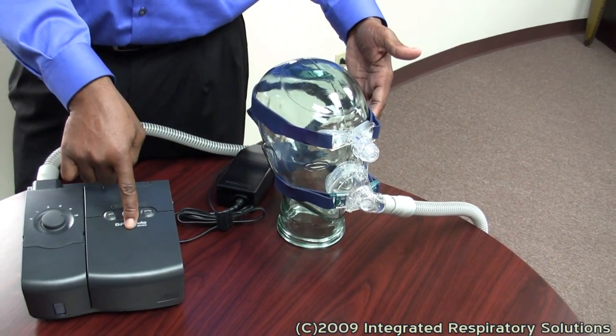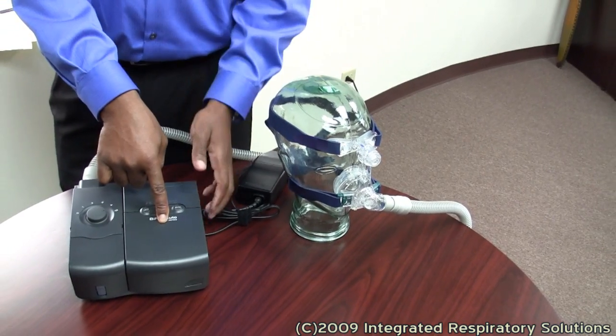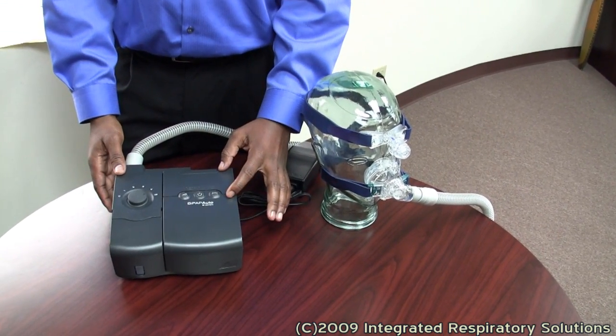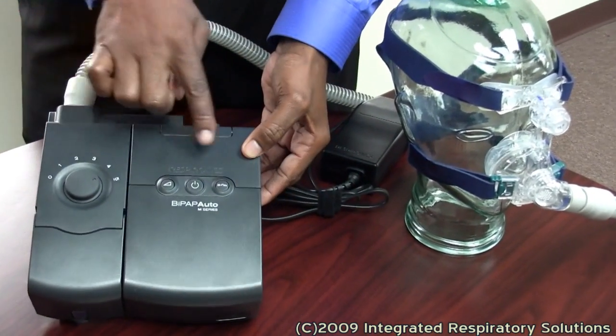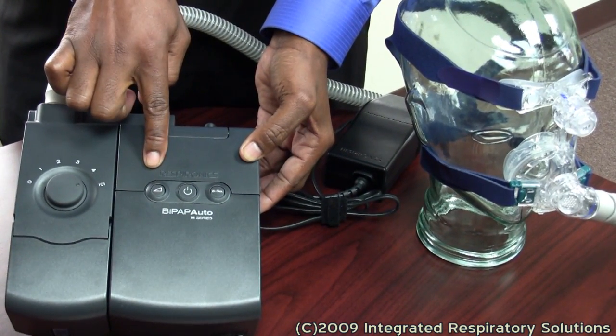This is the BiPAP device. There are three main manufacturers of this piece: ResMed, Fisher and Paykel, and this is a Respironics BiPAP device.